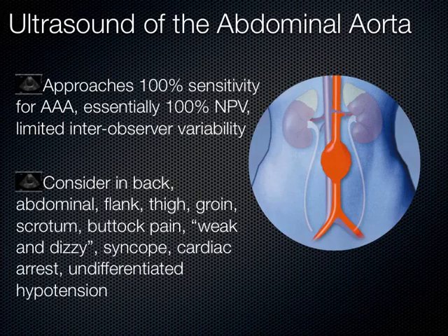This is not the case for appendicitis. That's very difficult. These are on complete opposite ends of the spectrum, okay? DVT, aorta, way over here, very easy. Last week, appendicitis, challenging, okay?